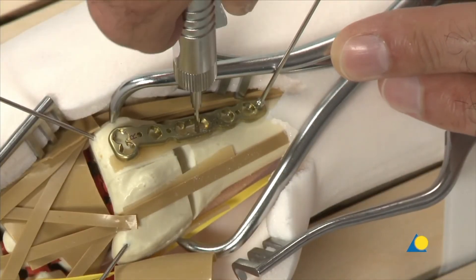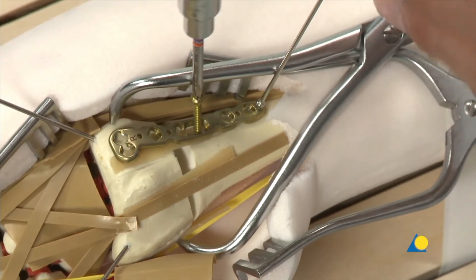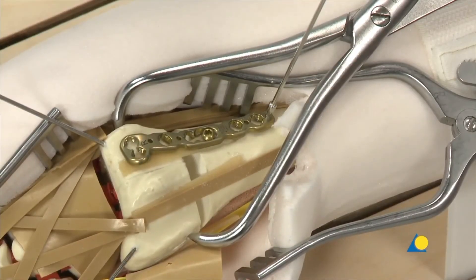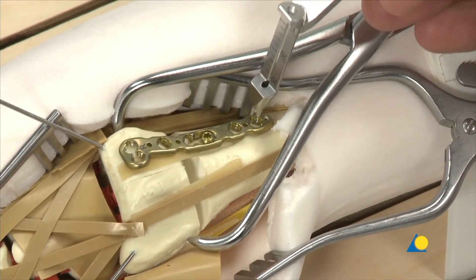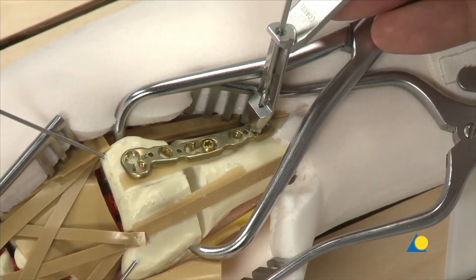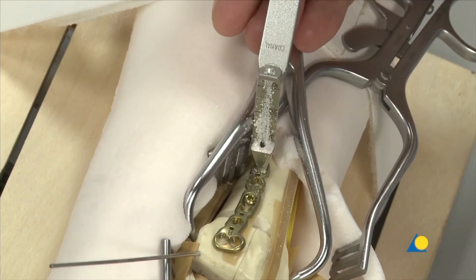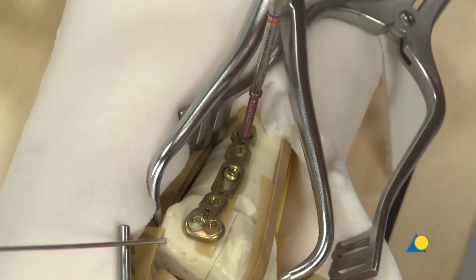The depth is measured and the appropriate length screw is inserted. The plate reduction wire is removed. At this stage it is important to check the reduction and placement of the plate under image intensification before continuing with plate fixation. The fixed angle end of the variable angle LCP drill sleeve is inserted into the most proximal plate hole, and the 1.8mm drill bit is used to make the screw hole following the nominal trajectory. The depth can be read off the scale on the drill sleeve and the mark on the drill. The appropriate length locking screw is inserted and fully tightened with the 0.8 Nm torque limiting attachment.